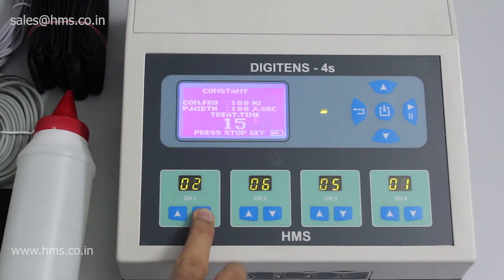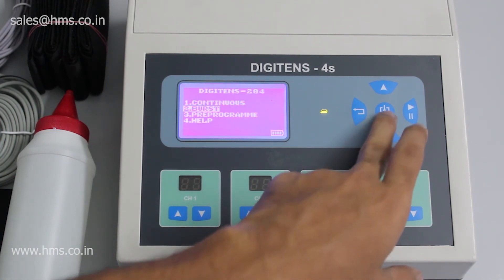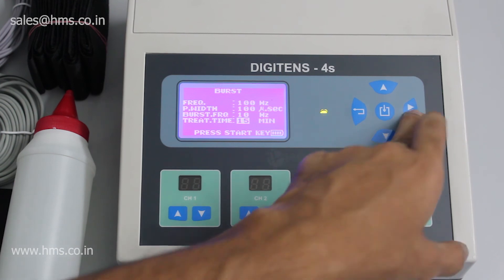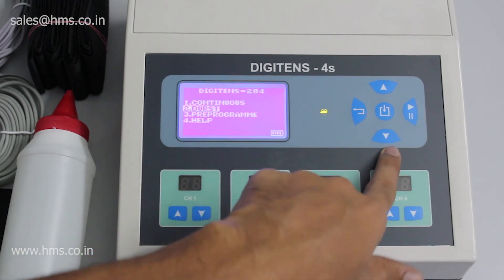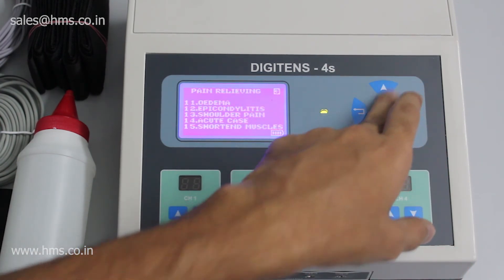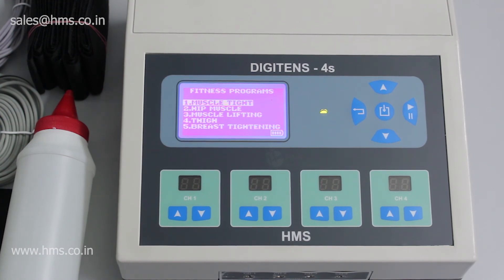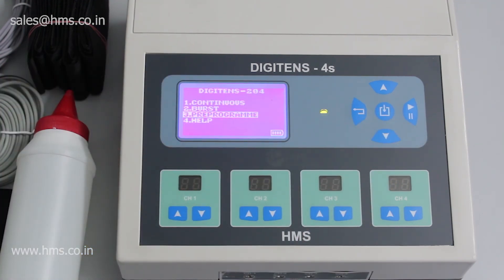That's the main advantage of digital TENS. Now let's look at burst mode — in burst you can set your frequency, pulse width, burst frequency, and treatment time. You can also change the intensity separately in burst mode. Moving on to pre-programs: there are two sets — the first is for pain relief, which contains 15 pre-programs, and the second is fitness programs with 5 different programs, giving a total of 20 pre-programs built into the DigiTENS 4S.